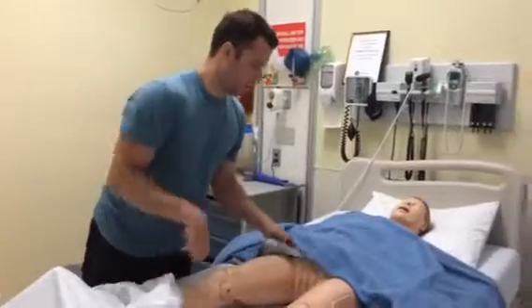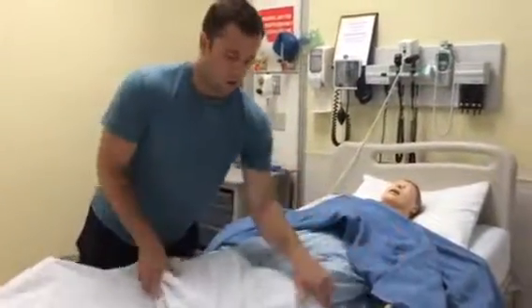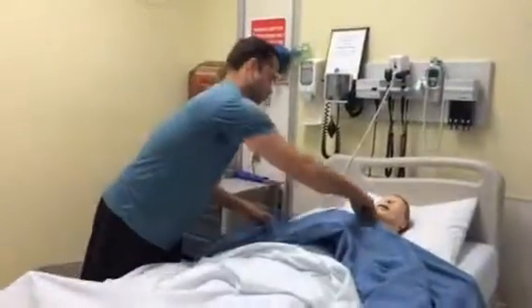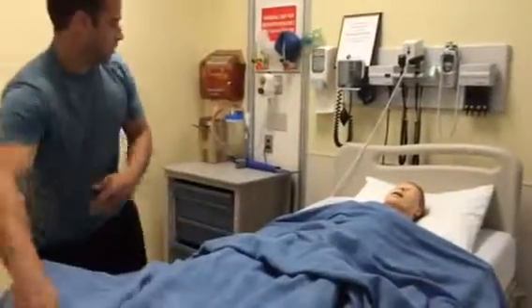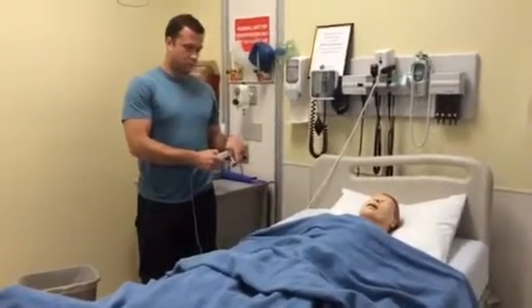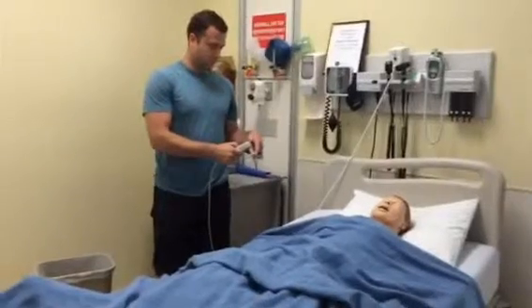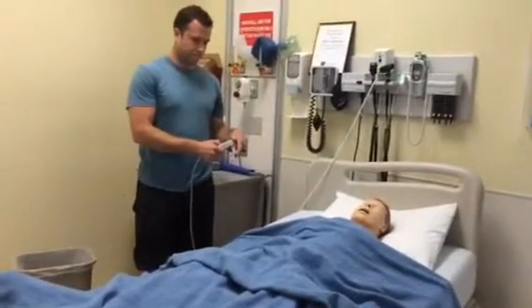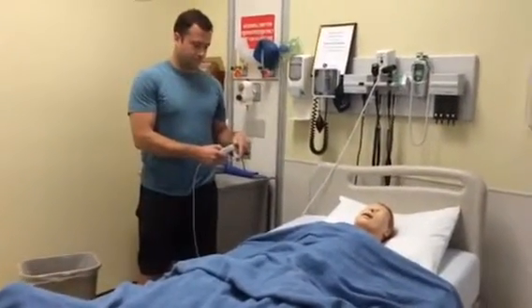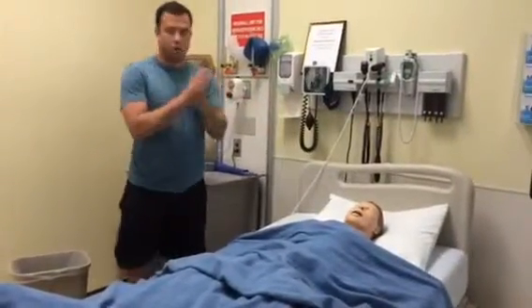And we can let the patient back to their routine. And I'll lower the bed back to its complete lowered position. And do hand hygiene, and we would be all set.